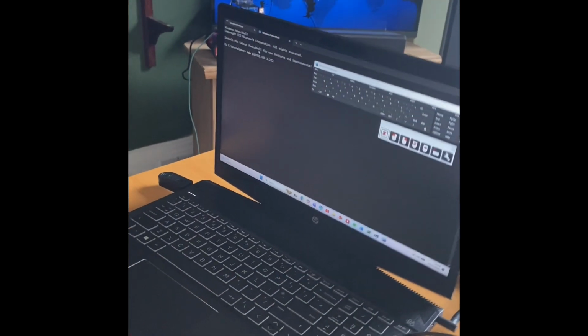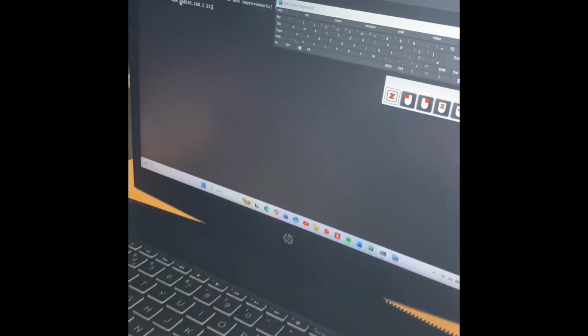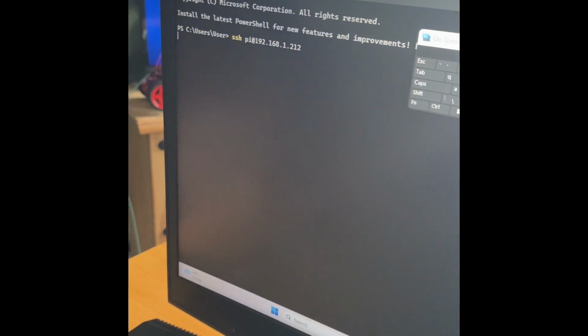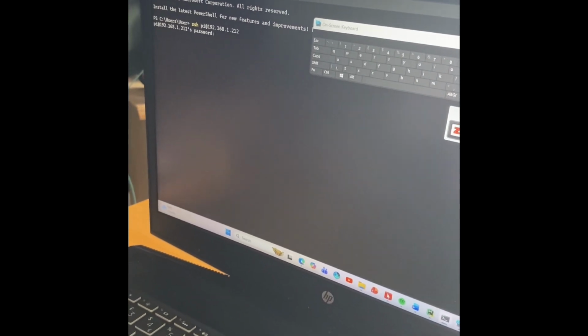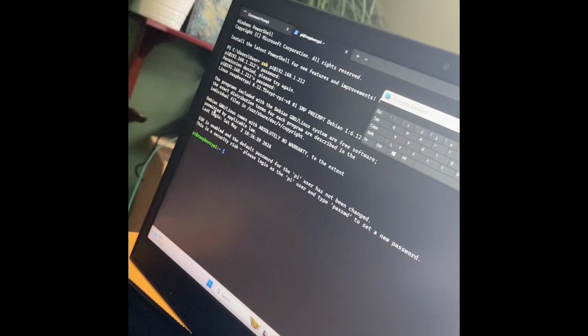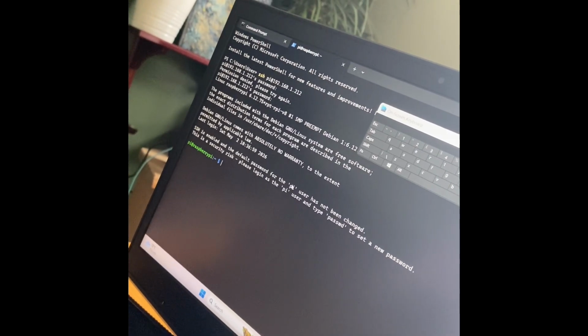On your computer, you will need to connect to the Raspberry Pi, so type the following command: SSH pi at, and then the IP address of the Raspberry Pi, and press enter. It will then ask you to put in a password, which I will enter now. See here, after I enter the password, enabled, so we are now connected to the Raspberry Pi.